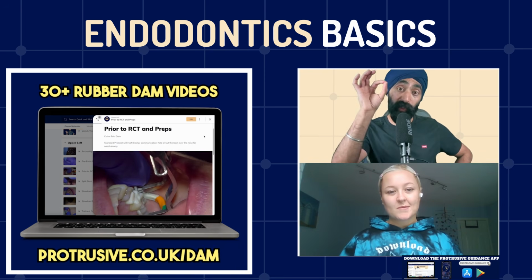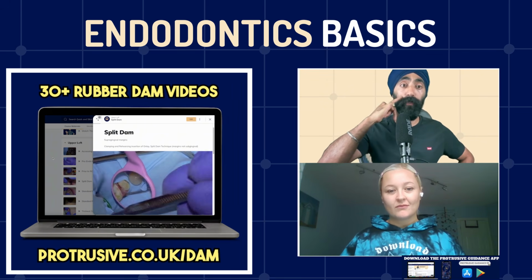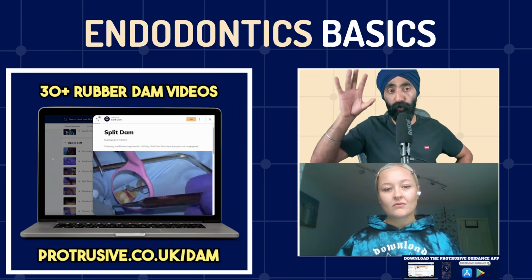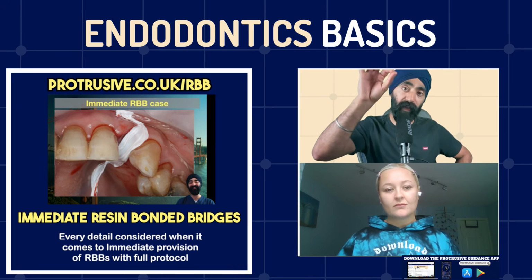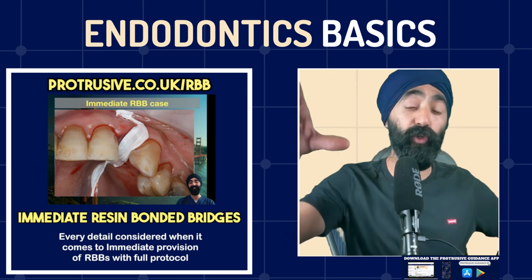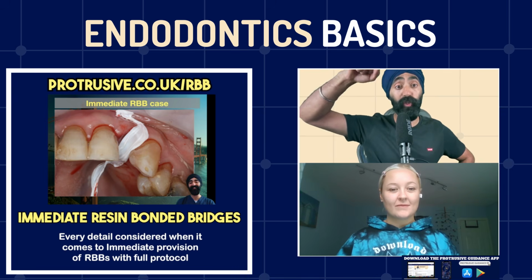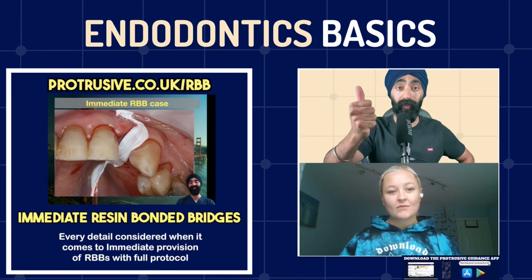So sometimes you can actually stick your GP cone into the sinus tract. Let's say the sinus tract is between two premolars and you don't know which, they're both premolars, look a bit dodgy, and you think, which one's the infected one? You can put a thin GP point in there until you feel a stop, and then you take a radiograph and it will show you on the radiograph which is the culprit. Okay. So anyway, if the sinus tract is gone, that's a success.